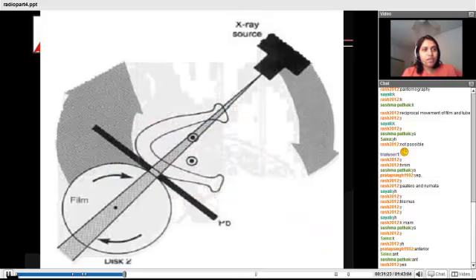Okay. Now in the second scenario, we are creating 3 centers of rotation. The first center of rotation will record the mandible from here to here, and then there would be a shift that records the mandible from here to here. Then there is another shift that records the mandible from here to here.